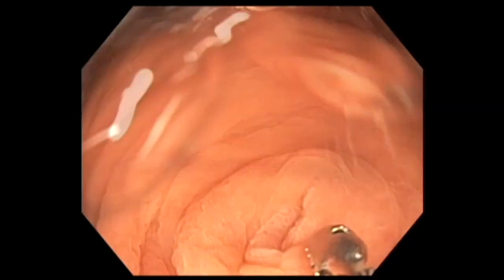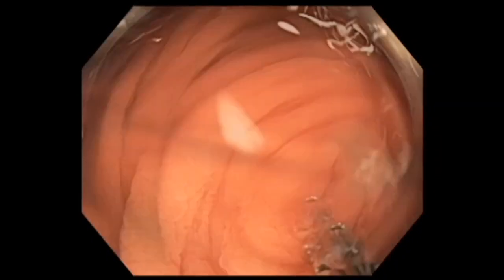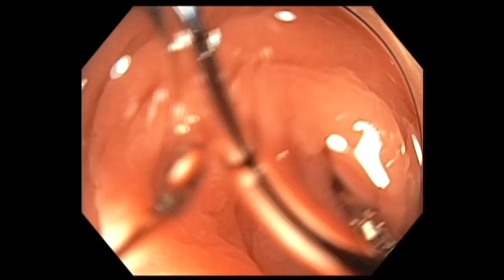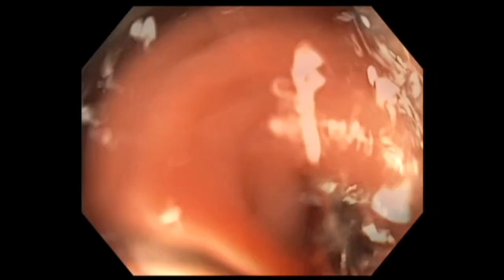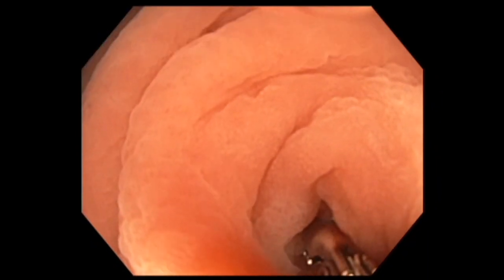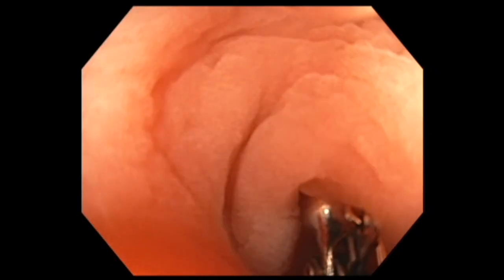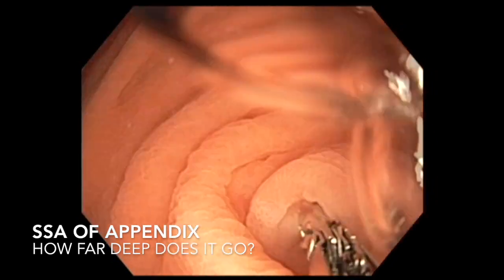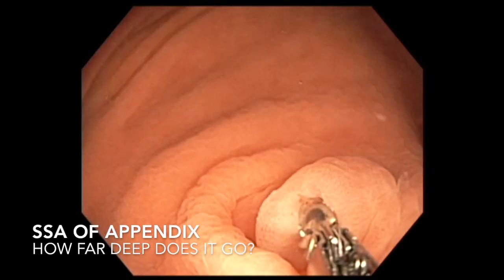Here we use a biopsy forceps to define the lower extent of the lesion further. As you can see, we are applying the forceps, holding the lesion first, and pulling it out. This lesion extended deep into the appendix and we could not define the lower edge.